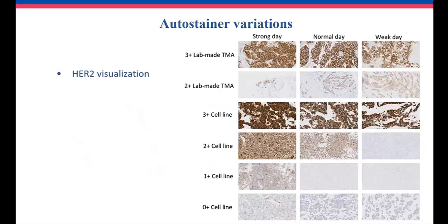We also visualized these results just to make it a little bit more apprehensible for the pathologist. Strong day, normal day, weak day for HER2. And you can see that this is a run control, that there is some variation. This is the 3+ cell line, which is fairly stable, even on a weak day. But you can see that for the 2+ cell line, there are big differences. On a strong day, it's really nicely in between 1+ and 2+, but on the weak day, it's way less than the 3+ cell line, and there's hardly any difference with the 1+ and the 0 cell line.